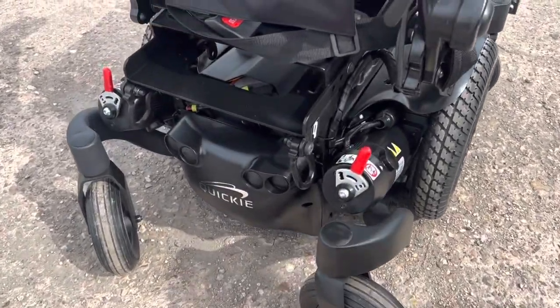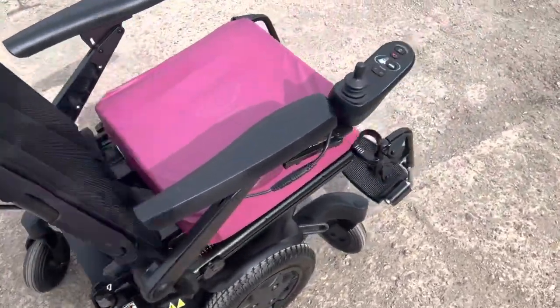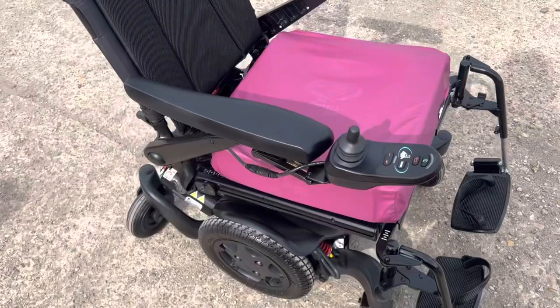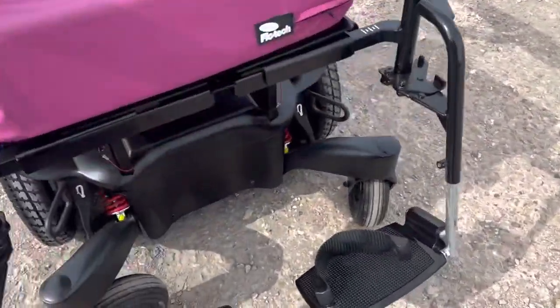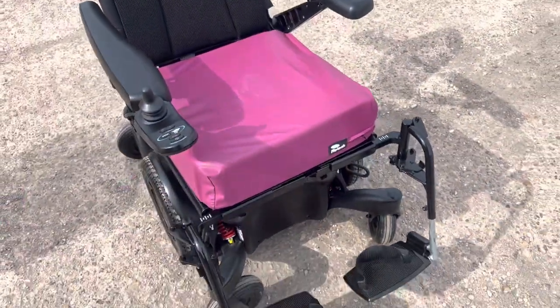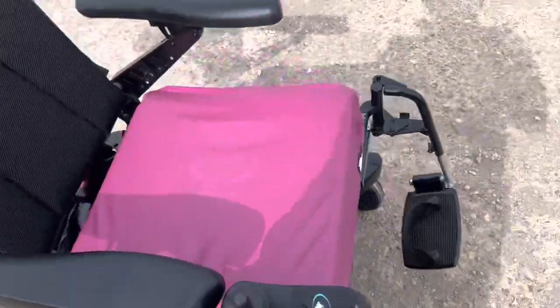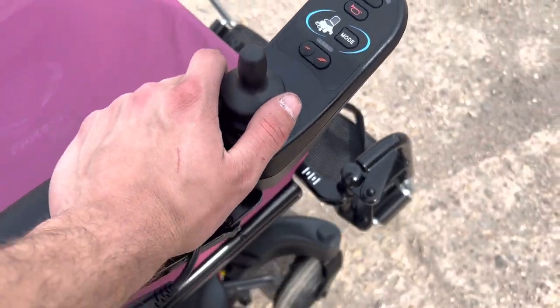The condition is immaculate. It's a 2021 model so the batteries are good to go — they've been fully tested. It's a big battery so you're going to get a good long range. Overall a really decent chair in great condition at a great price. It's got the updated joystick model, not the older one.